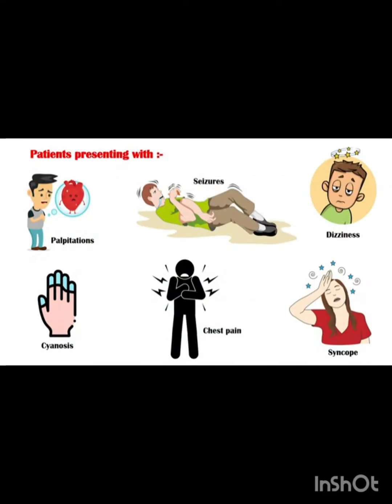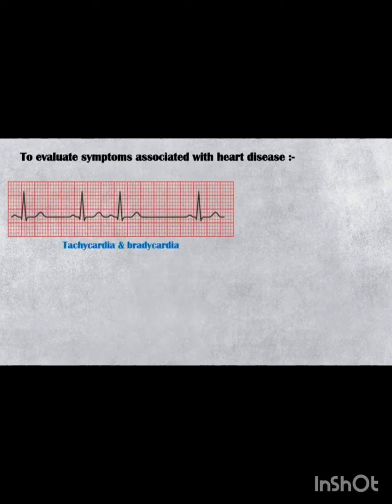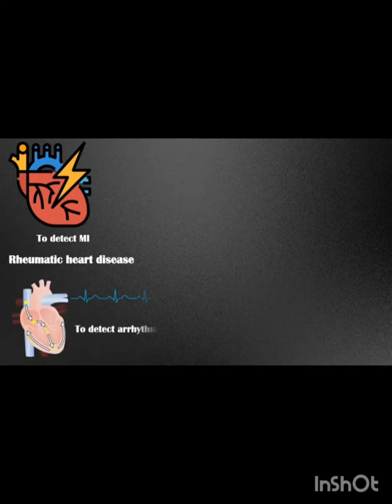In patients presenting with symptoms such as palpitations, dizziness, cyanosis, chest pain, syncope, and seizures. Symptoms or signs associated with heart disease, including tachycardia, bradycardia, hypothermia, murmurs, shock, hypotension, and hypertension. To detect recent and previous myocardial infarctions. Rheumatic heart disease. To detect arrhythmias and electrolyte imbalances.